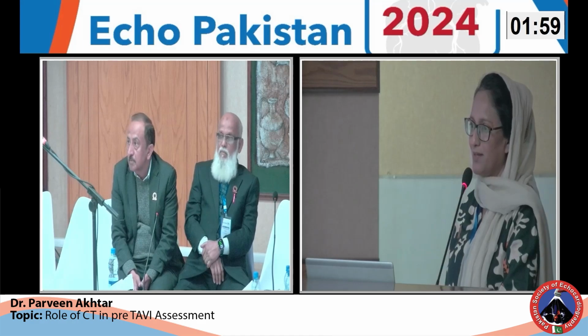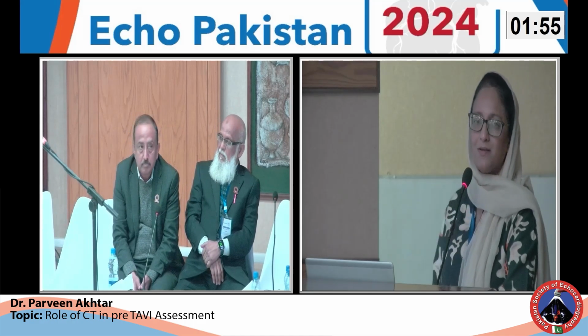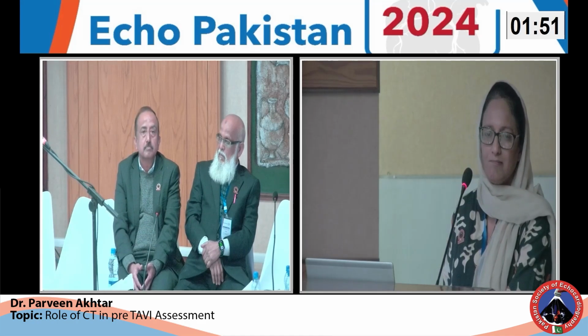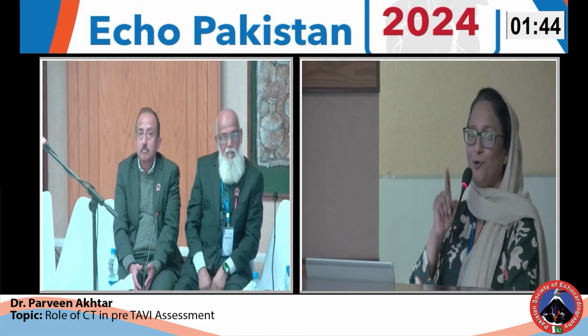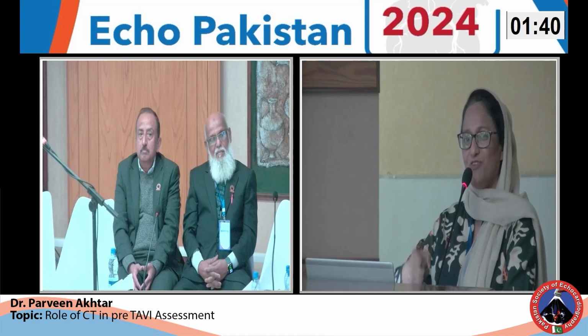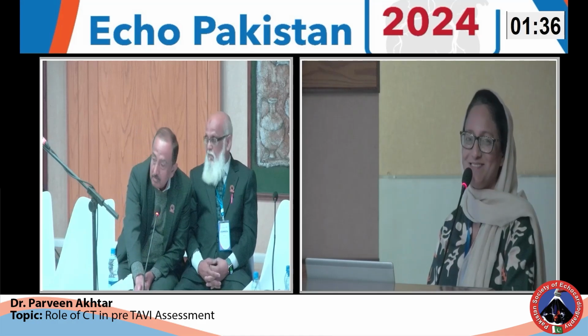Dr. Parveen, very nice talk. Have you used this hybrid method? I'm going to talk about that in my talk, but using the aortic annulus by CT and the peak gradient by Doppler. Have you used that? Yes, LVOT by the CT, and they put this value in. That is a very popular thing nowadays. So how do you find it and how do you compare it?